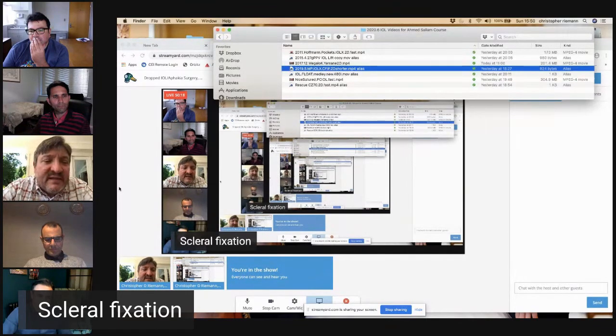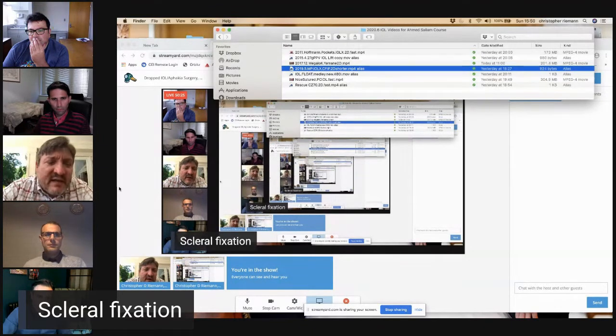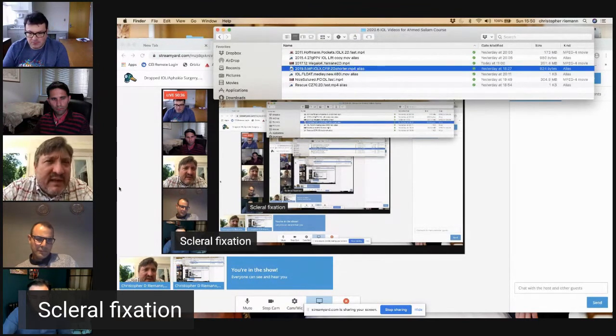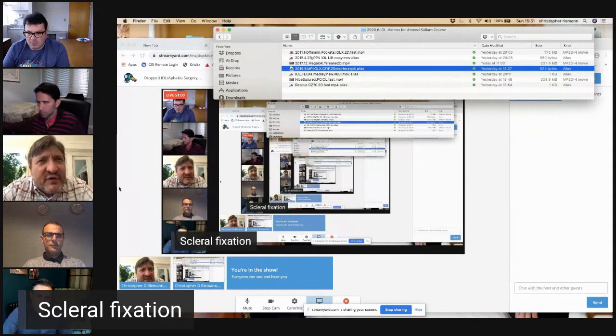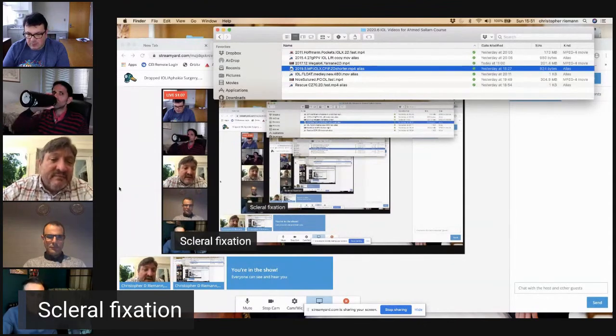But the key thing is that it reduces glare, it collimates, it creates a pupil, it reduces irregular astigmatism, it reduces higher order aberrations in patients, and gives a great cosmetic result. We never put these iris implants in for cosmetic purposes, just to change the color of the eye. That's absolutely unacceptable and unethical. But for a functional patient like this, to take him from a horrible abnormal pupil to a normal pupil and relieve his glare complaints, plus give him a decent cosmetic approach, it's a wonderful way to reconstruct these eyes. And like Ahmed said, there's coverage now and there are Medicare codes that go into effect actually July 1. So we're excited. Very nice.